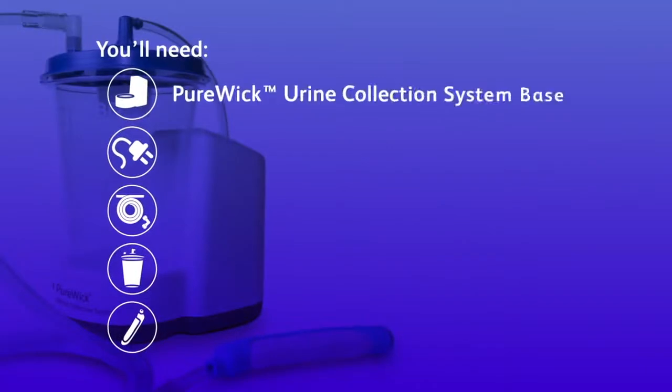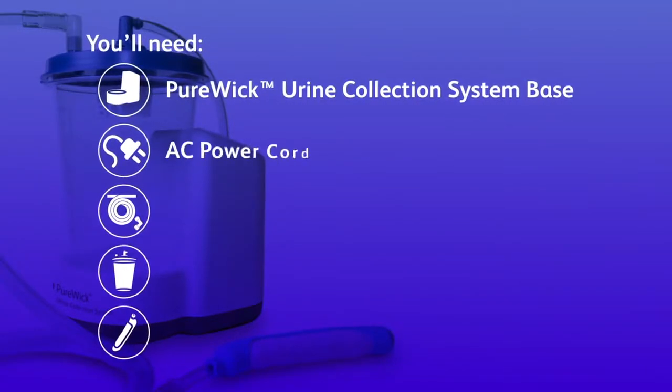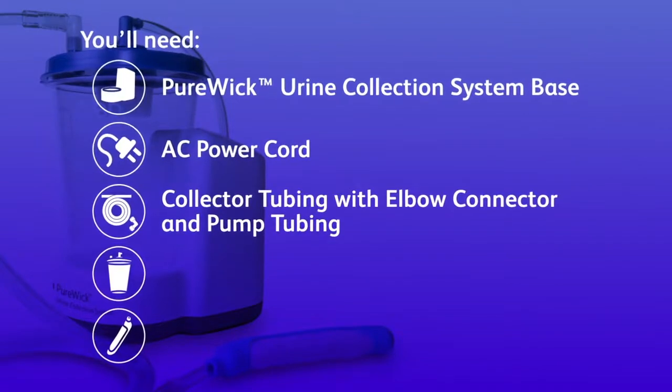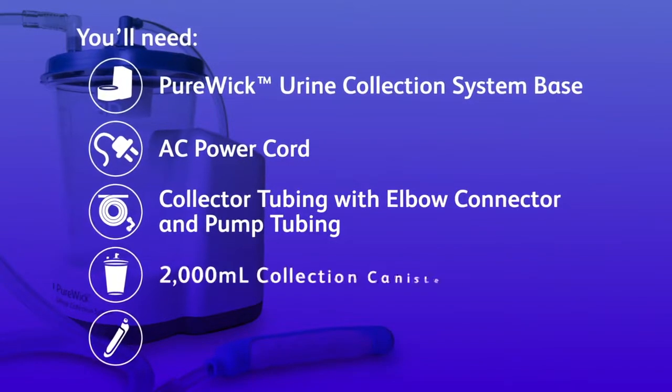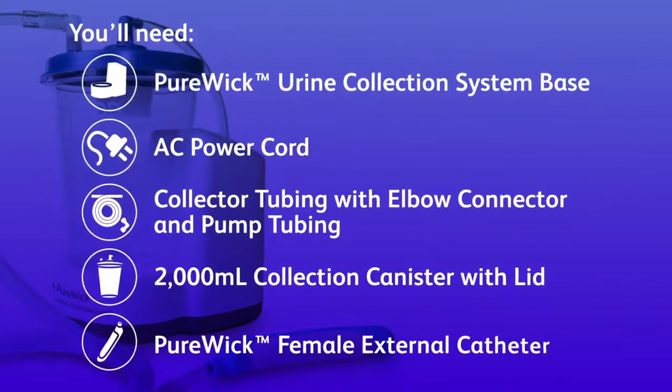You'll need the Purewick Urine Collection System Base with or without battery, AC power cord, collector tubing with elbow connector and pump tubing, 2,000 milliliters collection canister with lid, and Purewick Female External Catheter.